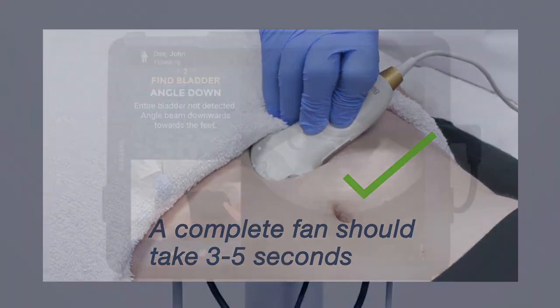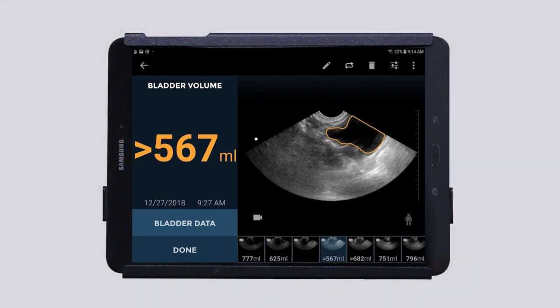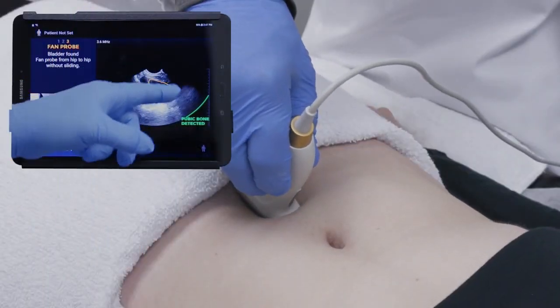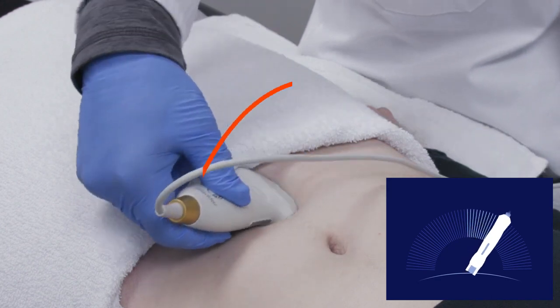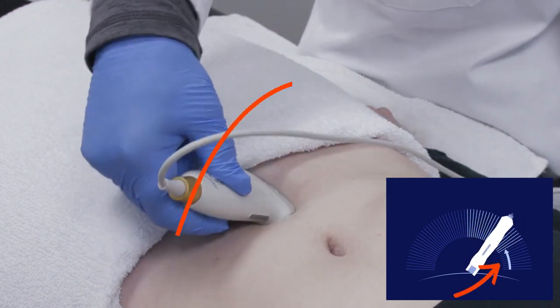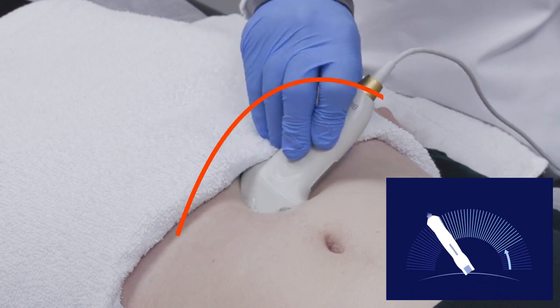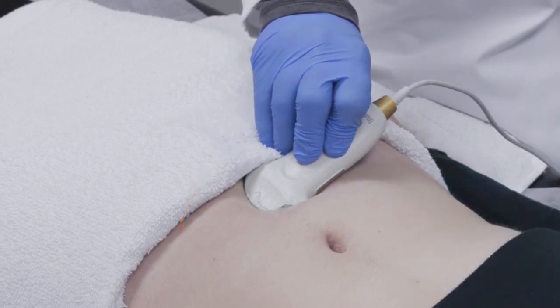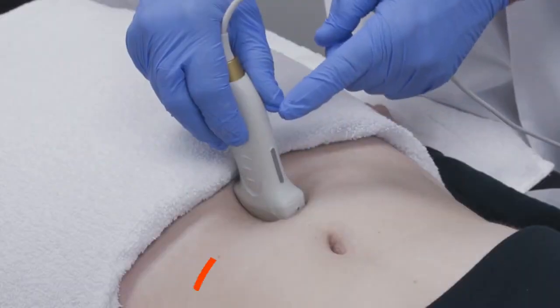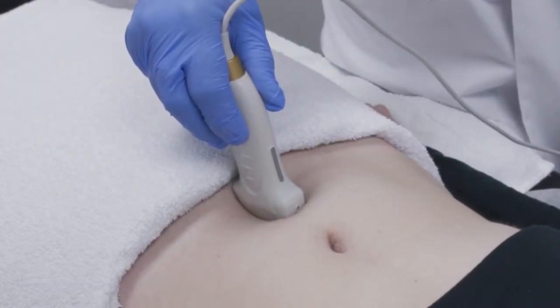If the greater than symbol appears along with the volume measure, there are some actions that can be helpful. Make sure the bladder is centered on the screen and that you are fanning the probe towards one hip until the sound indicator is heard and an arrow is seen. Then fan back towards the other hip until a second sound is heard to capture the entire bladder. Anchor the pivot point to ensure that the probe does not slide in any direction while fanning.